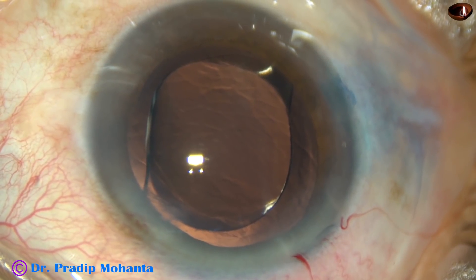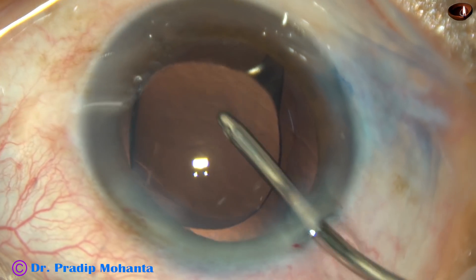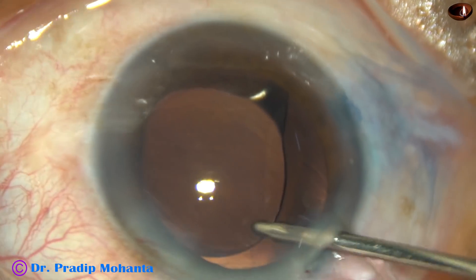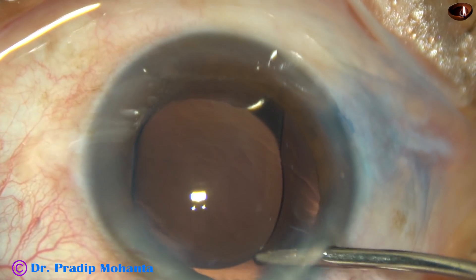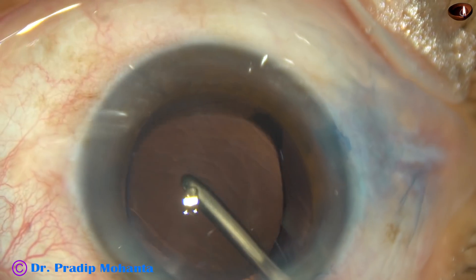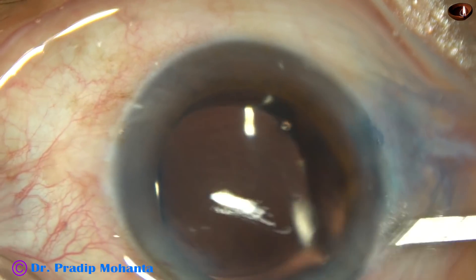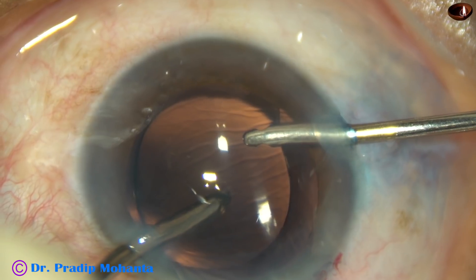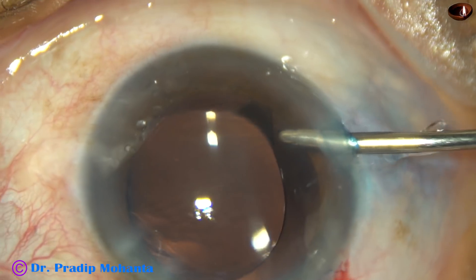Yes, the lens is in the bag. Now, the viscoelastic that was used before implanting the intraocular lens is thoroughly cleaned out. Visco is removed by the irrigating probe of bi-manual I/A, and then both the irrigation and aspiration cannulas. You must go behind the IOL and clean the visco from the capsular bag. And now, the visco is thoroughly removed from the anterior chamber and the capsular bag.